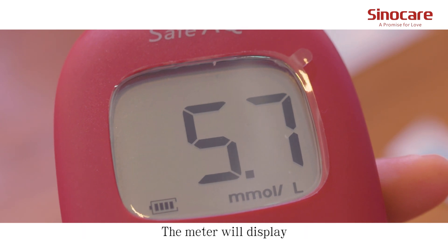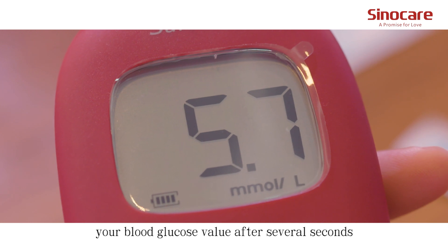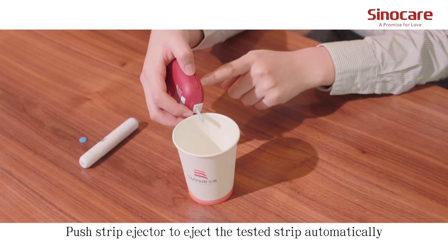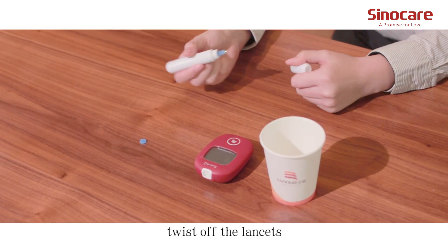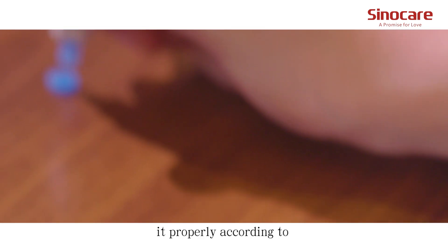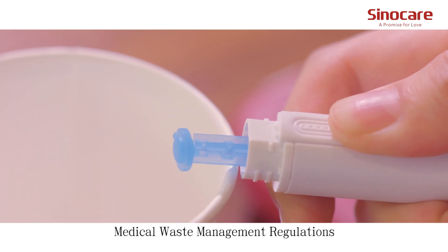The meter will display your blood glucose value after several seconds. Push the strip ejector to eject the test strip automatically. Twist off the lancet, cover its cap, and dispose of it properly according to medical waste management regulations.